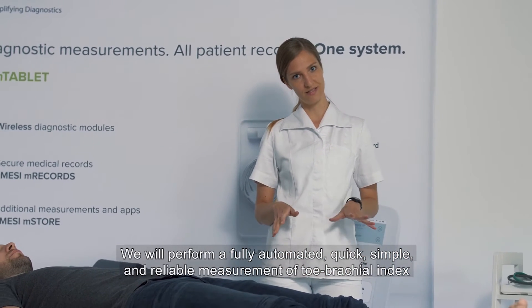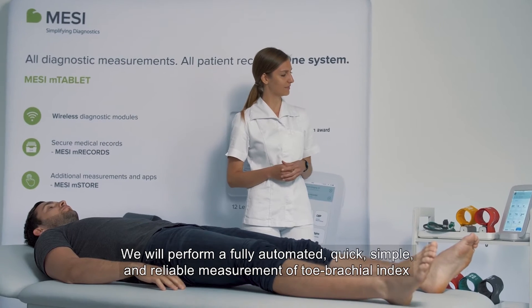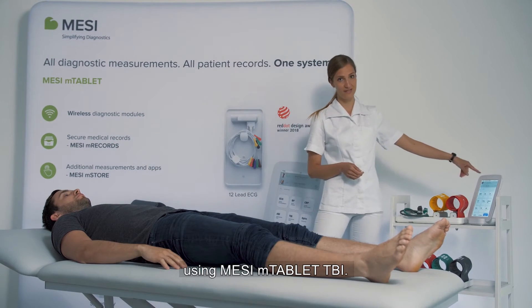We will perform a fully automated, quick, simple and reliable measurement of toe brachial index using MTablet TBI.